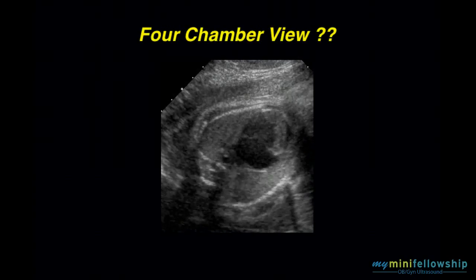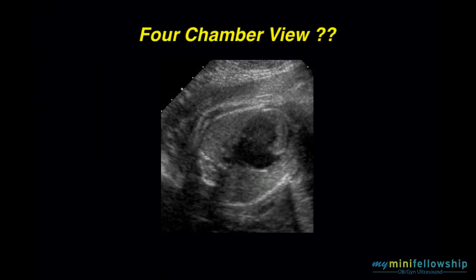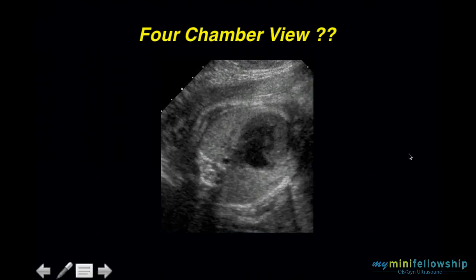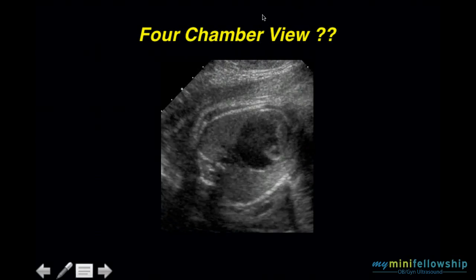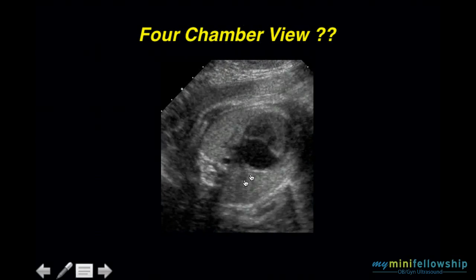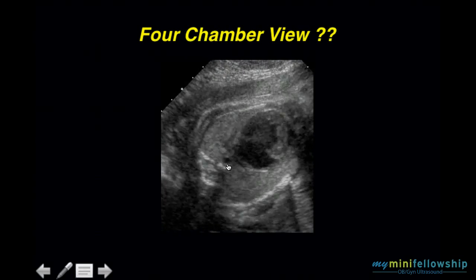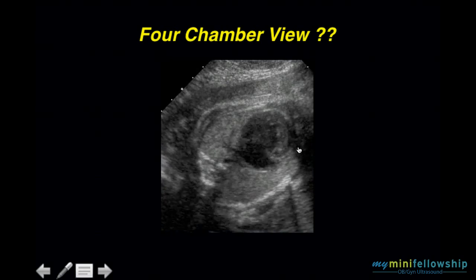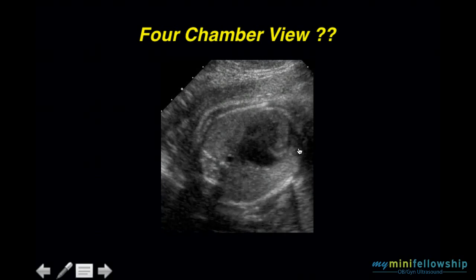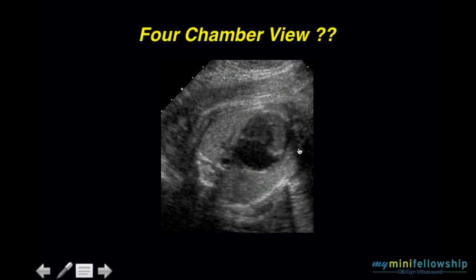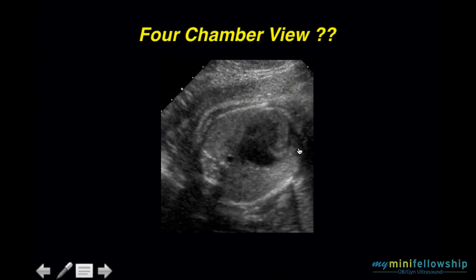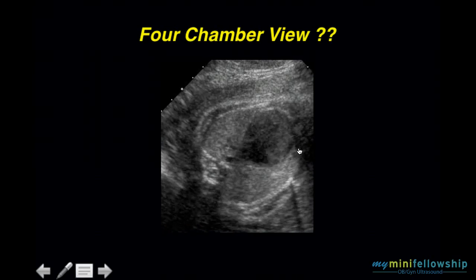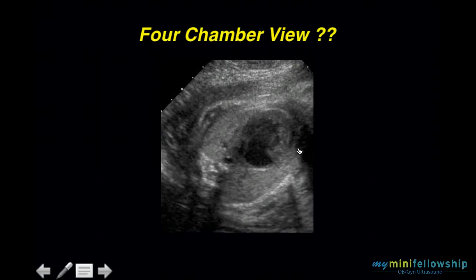That system works in all orientations. So when we're looking at this case and we see spine, descending aorta, left atrium, left ventricle — oops. All of a sudden, without question, we have an abnormal four-chamber view.